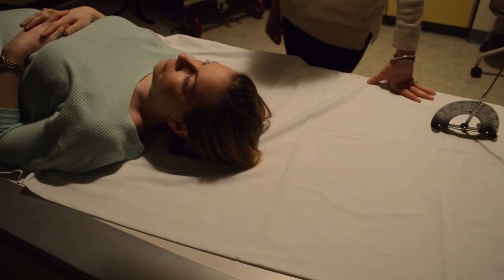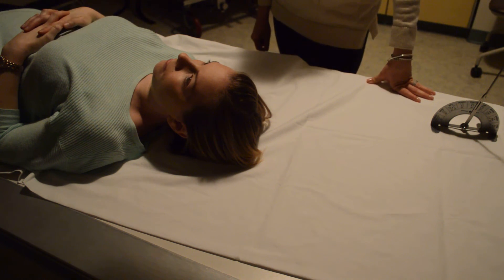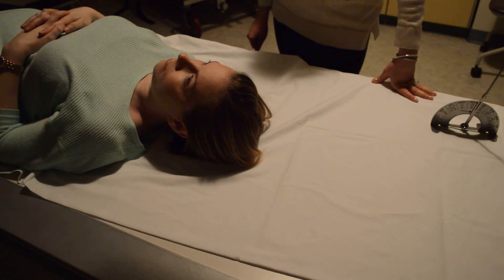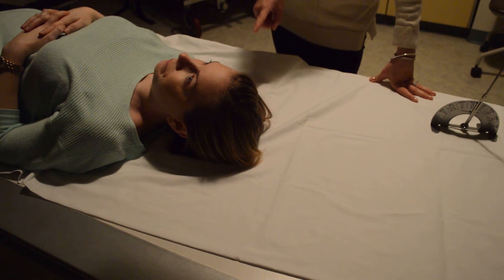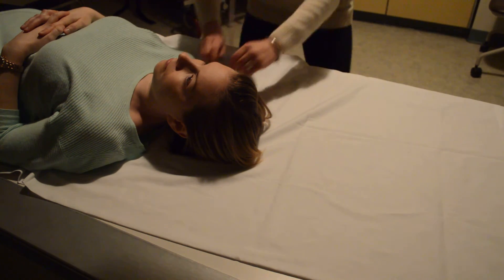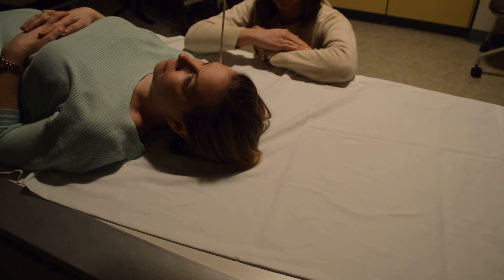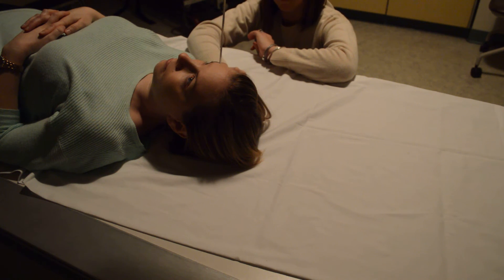The last trauma view is going to be the Caldwell. Normally the patient is in PA and we're doing a 15 degree caudal tube tilt to OML. So what we have to do is find what Libby's OML is — which we just did; I'll double check it and make sure we're still at 10. Since she's AP now, I want to be 15 degrees cephalic to whatever her OML is.